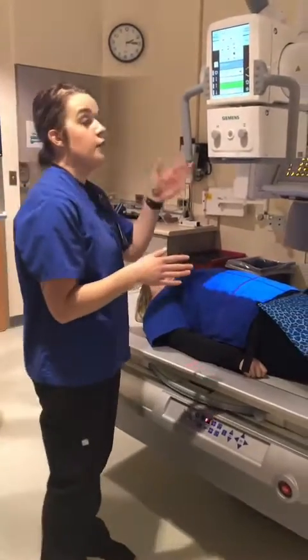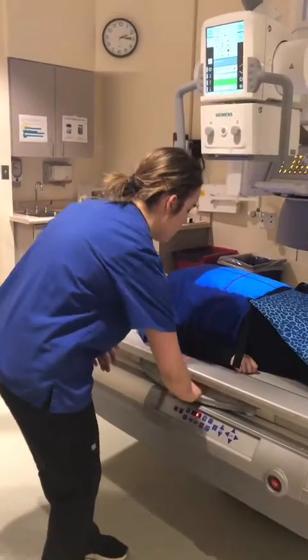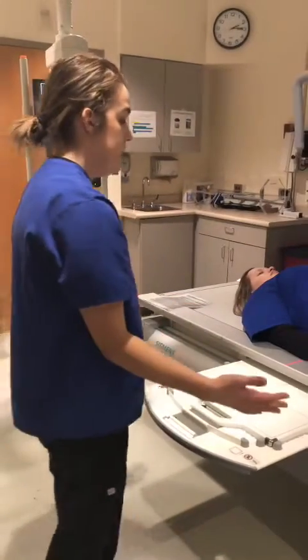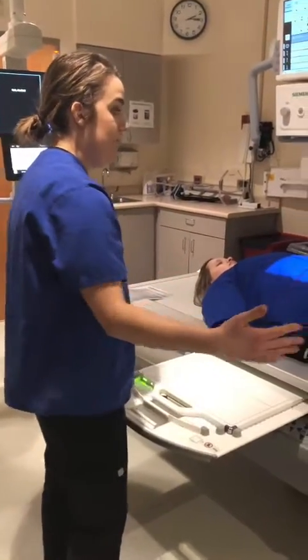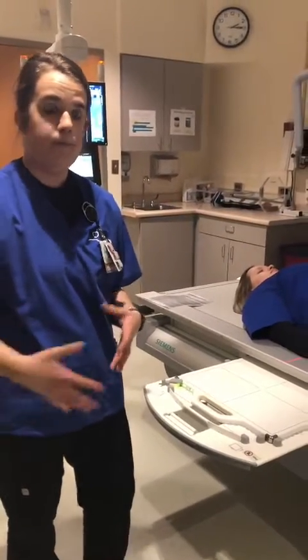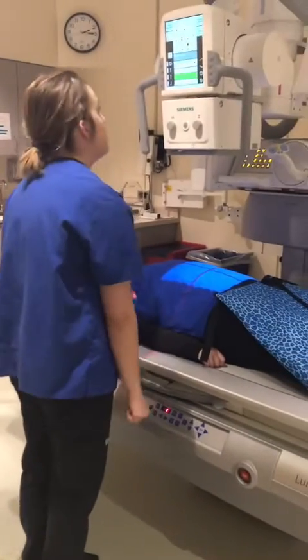I have a 40-inch SID. I'm going to pull my image receptor out here. I have a 14x17 image receptor, and it is lengthwise, along the length of the patient, making sure that we get all of the abdomen on that image receptor. I'm going to stick this back in here, making sure that it goes all the way in.